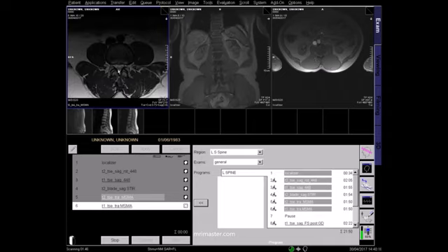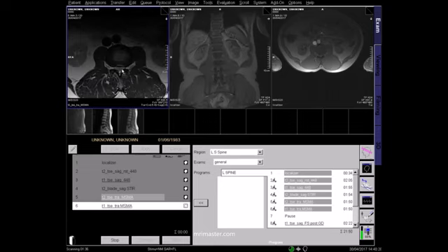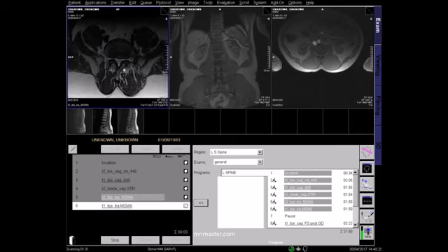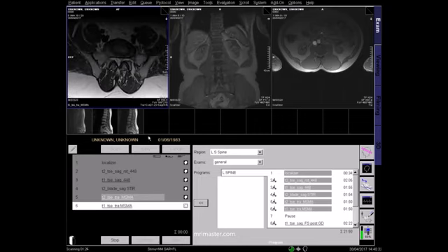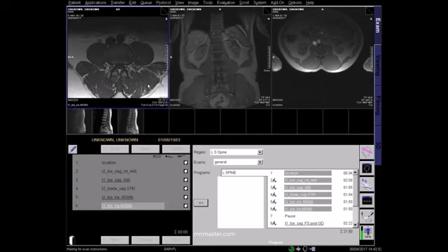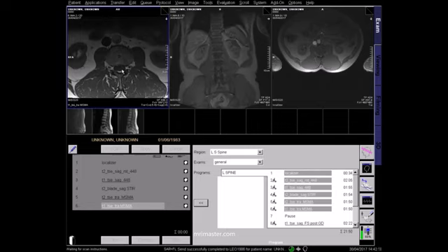This is a multi-slice, multi-angle T2 axial image. Within the bright cerebrospinal fluid, the descending spinal nerves can be clearly seen, as can any impingement of the spinal canal from prolapsed intervertebral discs. And this is a multi-slice, multi-angle T1 image, where the CSF appears dark and the spinal nerves appear grey.